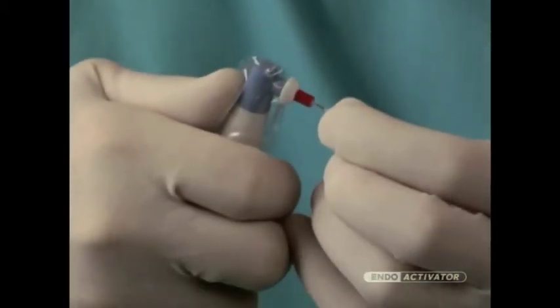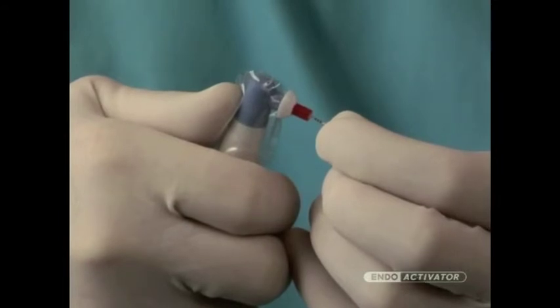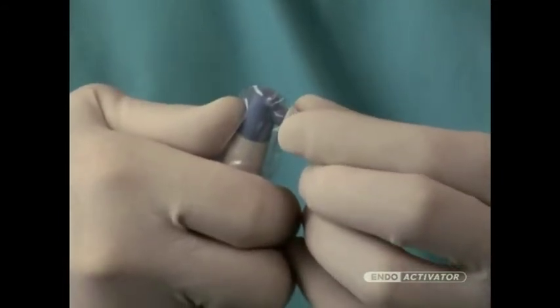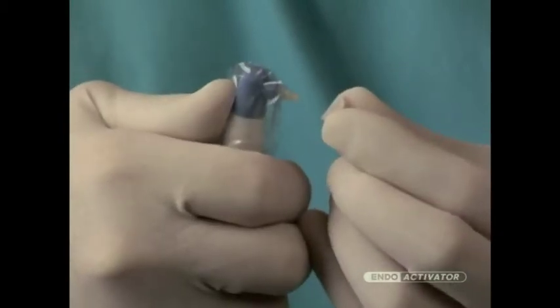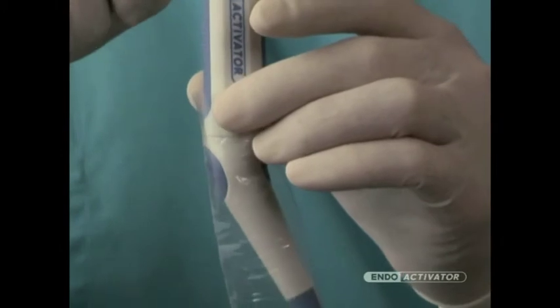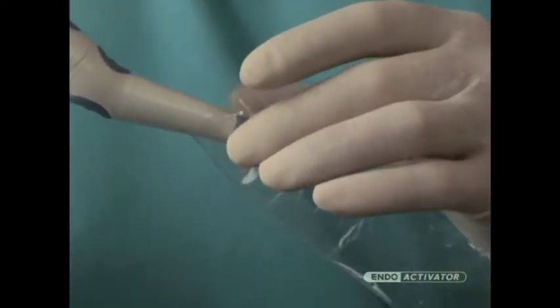When the clinical procedure has been completed, firmly support the contra-angled nick of the handpiece and remove the attached activator tip by grasping the large circular clean guard portion with fingers and snap off. Next, remove the protective barrier sleeve. Discard the activator tip and barrier sleeve as they are for single patient use only.